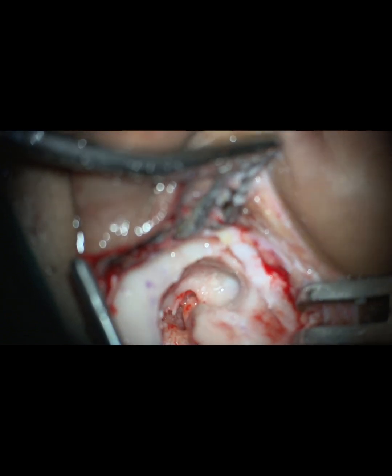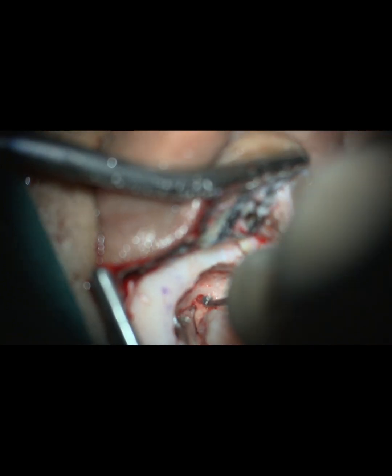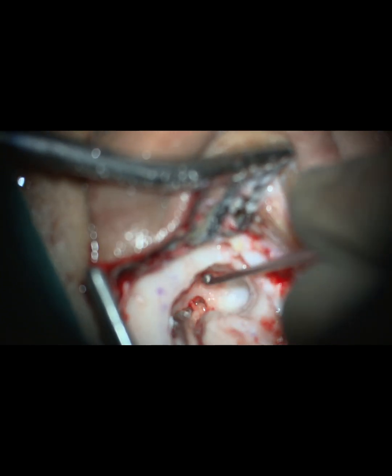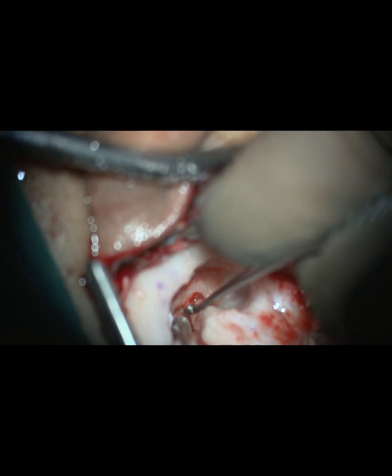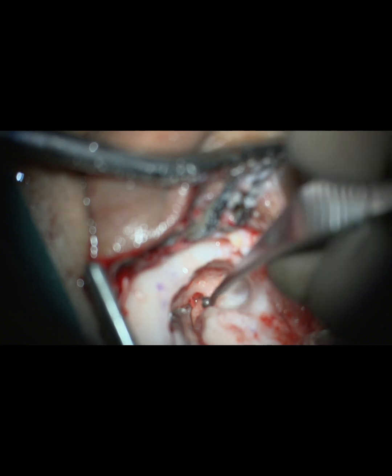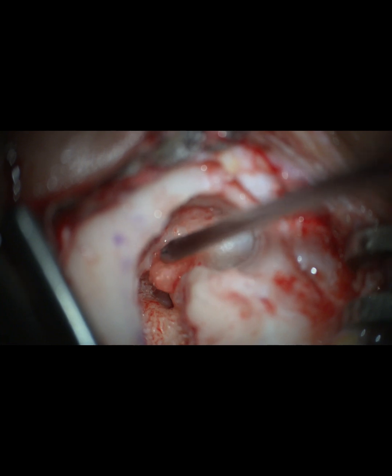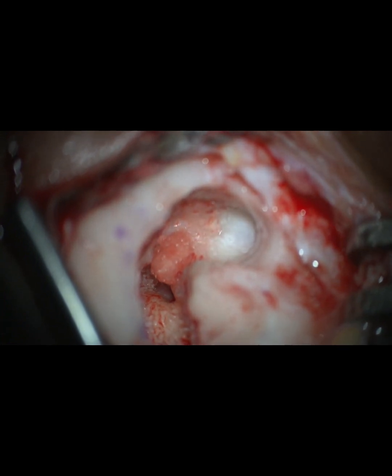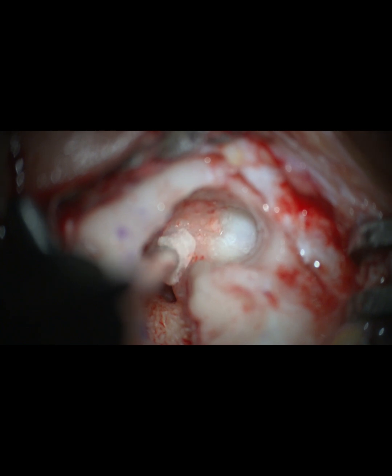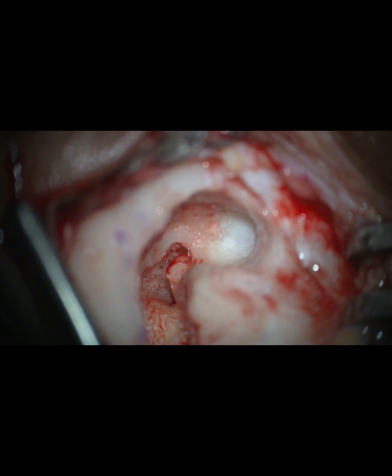You can now see the body of the incus. And after further curettage, deformed malleus will also come into picture. This is the buttock sign, where the malleus and the incus appear as two prominences in the attic.